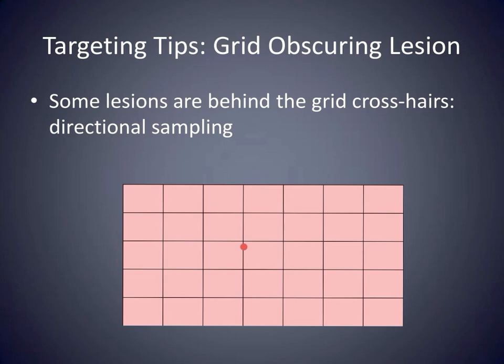So for example, in the phantom case that we've seen, the final depth for that target lesion, if you were to perform the biopsy without the needle guide block, would be 5 centimeters. Once again, although the thickness of the needle guide block is different for various systems, in this particular scenario, since we are not using the needle guide, no adjustment factor is required.